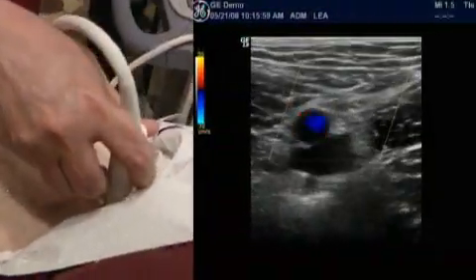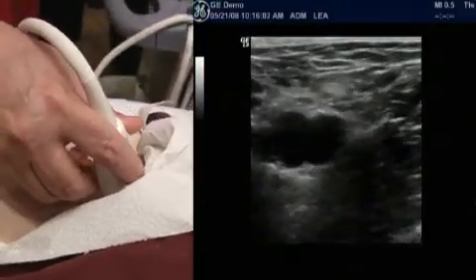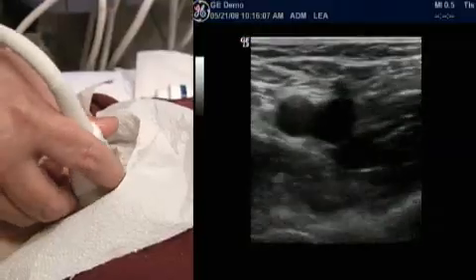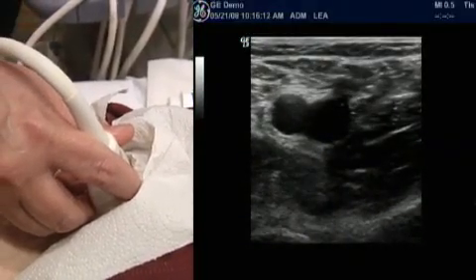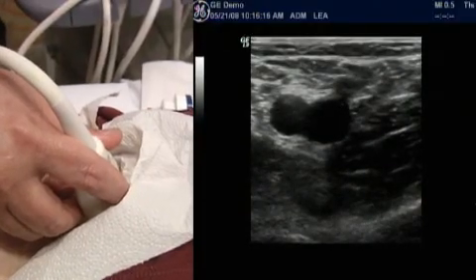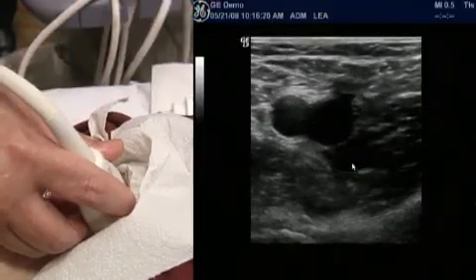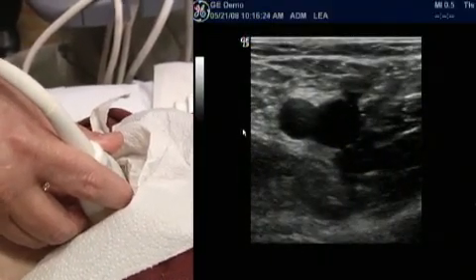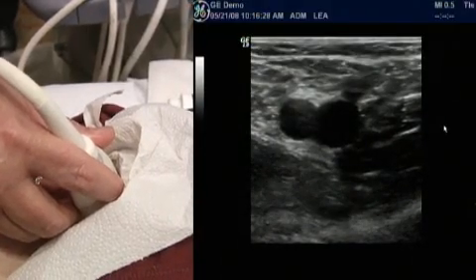I usually just start with a transverse view, right pretty much as high up as I can, and try to find the saphenofemoral junction, which, let's see, let me just bring up a trackball, or the cursor, right, yeah. Up here on the screen, you can see we have this oriented, obviously, so the patient's right is on your left, and the patient's left is on our right.